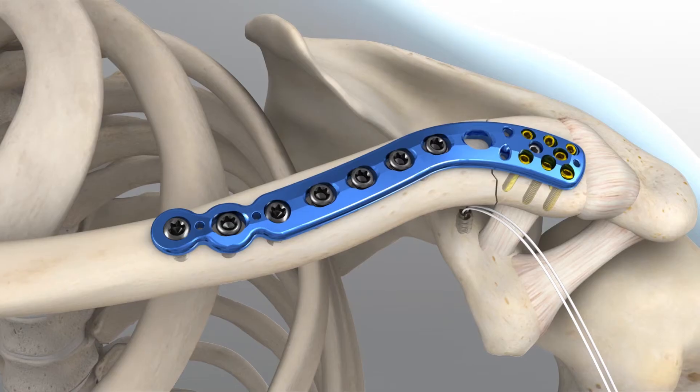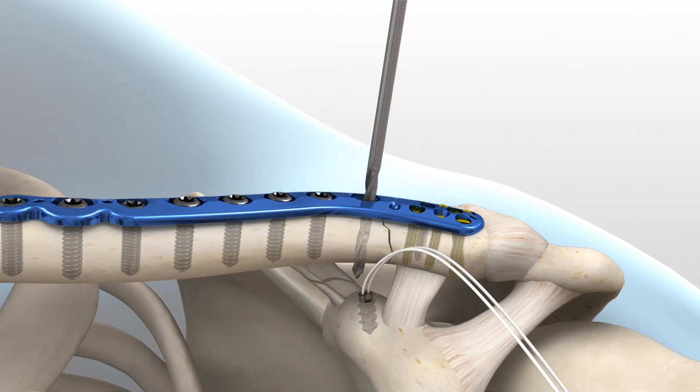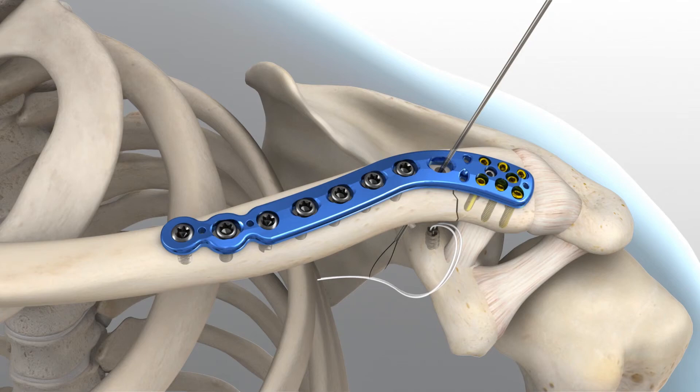To drill the clavicle for the AccuSynch repair system, identify the slot to tie the suture above. If two anchors are used, be sure to keep these slots unfilled while inserting non-locking screws into the remaining compression slots. Using a 2.8 mm drill under power, center the drill in a slot and drill through both cortices of the clavicle. When drilling through the slots, use precaution to protect the suture from the drill bit and to avoid damage to neurovascular structures. Use a suture retriever to pull both suture strands superiorly from the anchor through one hole in the clavicle and through one plate slot. If two anchors are used, repeat suture passing with the second strand.